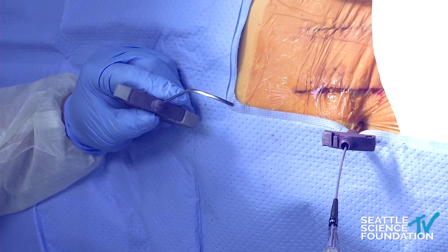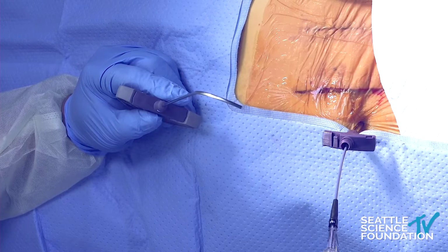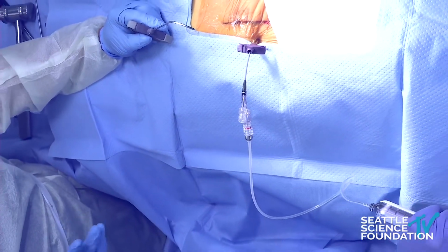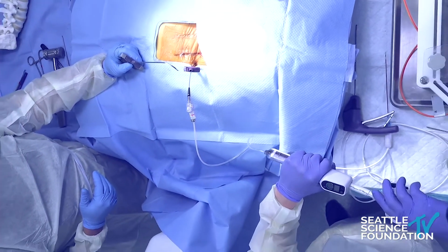Of course, there are, as you're going to show later on today, some of the spinal implants used to provide some height restoration in vertebral augmentation with the SpineJack. But for balloon kyphoplasty, this is a great way to provide height restoration and reduce kyphosis.